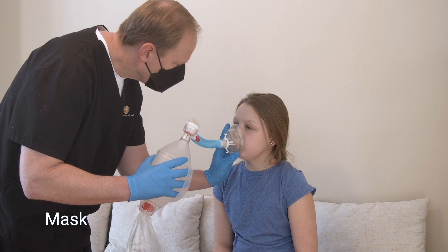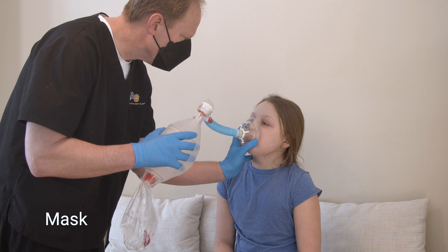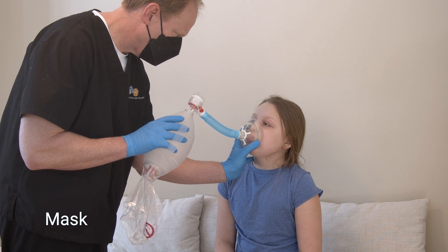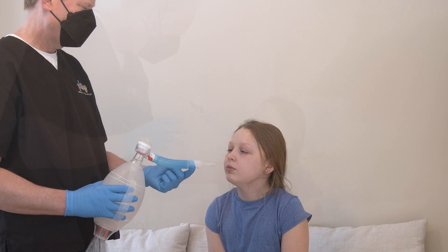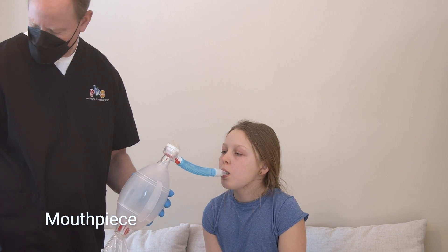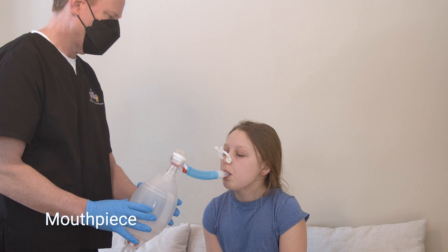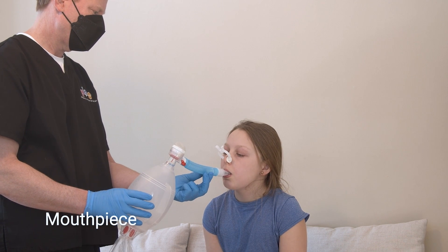Put the mask over your child's mouth and nose. Make sure their chin is up and the mask forms a tight seal on their face. You can also use a mouthpiece and nose clip. Put the mouthpiece into your child's mouth and the nose clip on their nose. The nose clip prevents air from leaking during the treatment.